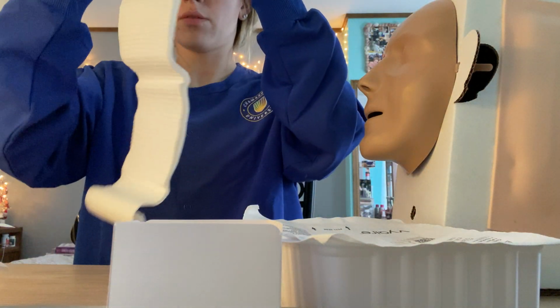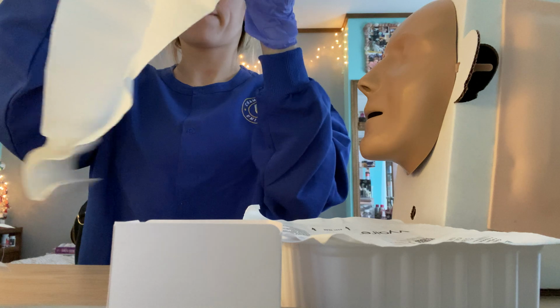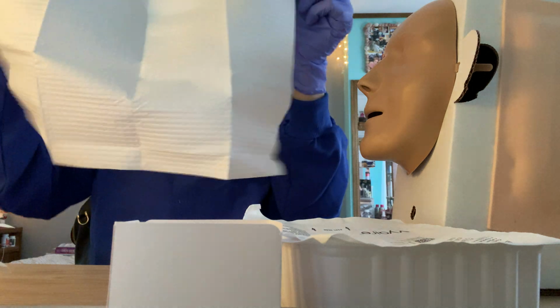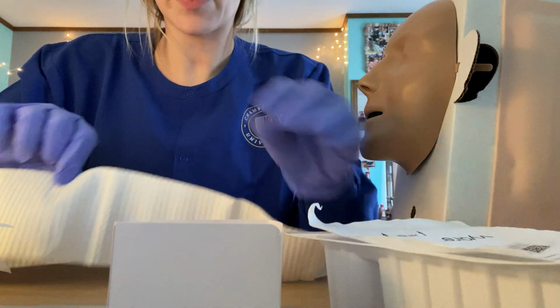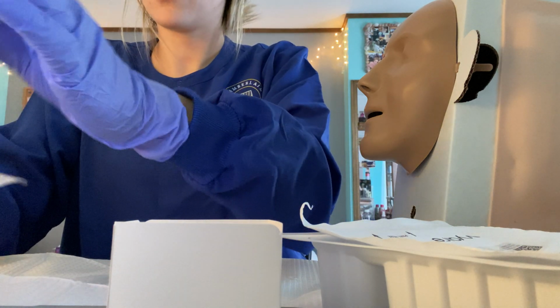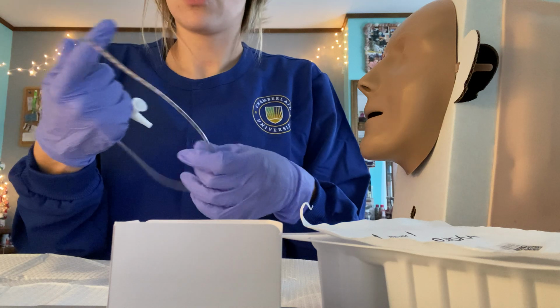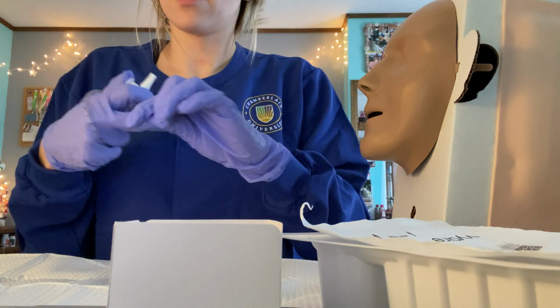Prepare my sterile field. The 1-inch border. Border around it. Okay, and then I have lack of space, so it's kind of hard to stay sterile, but you would only have 1-inch borders and you make sure you stay in the sterile field. And then I will get my suctioning out and I will coil it in the dominant hand that I'm using. So I would coil it in this hand. Make sure I have it right there. Coil it. Okay, so I have it right there.